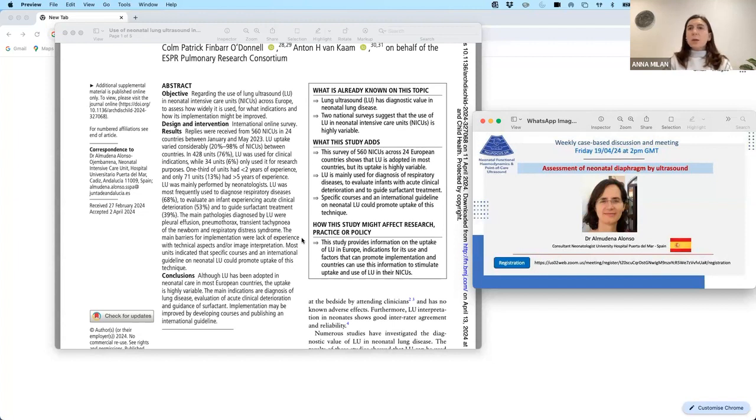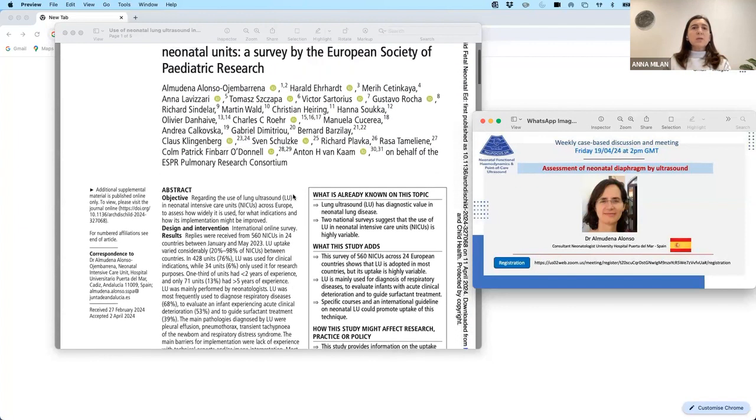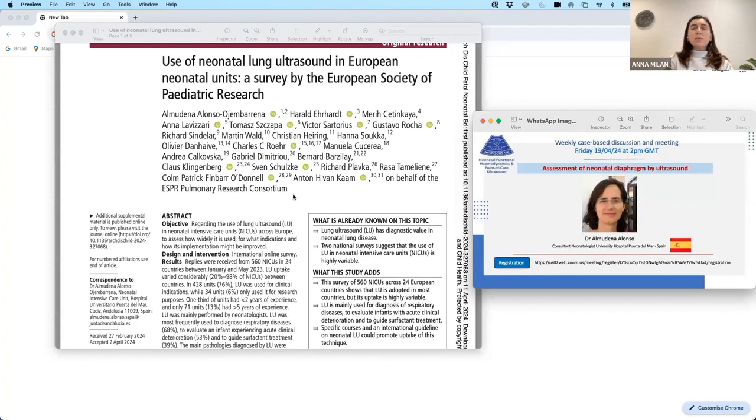Specifically today, she will be talking about the assessment of the neonatal diaphragm function. One of the tools that we know we have in our toolbox is to use lung ultrasound to assess the readiness for extubation, which in some centers has been studied as a combination of lung ultrasound results combined with diaphragm function, again assessed by ultrasound. So we are hoping to learn something new from Almudena, who I think has just managed to join us. And I will stop sharing and rambling.